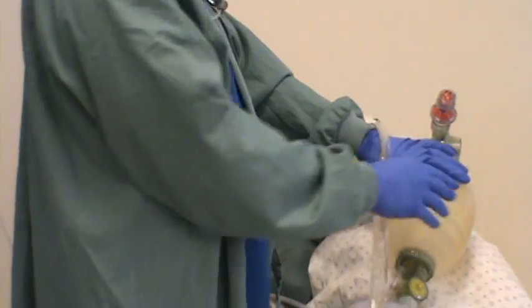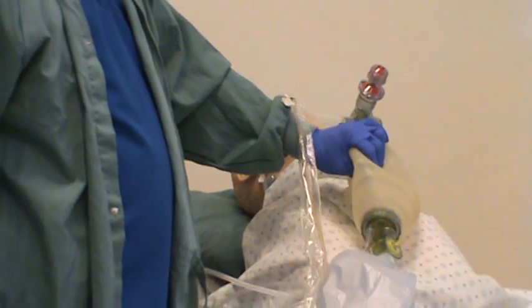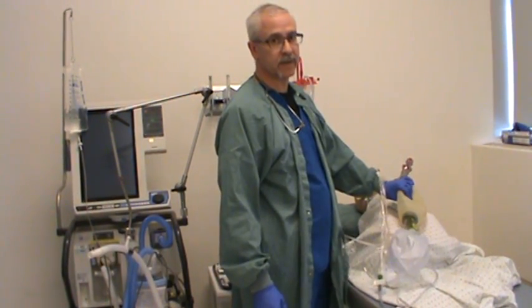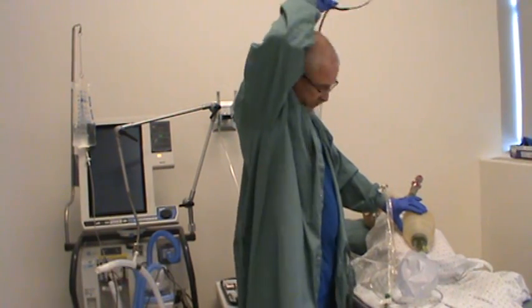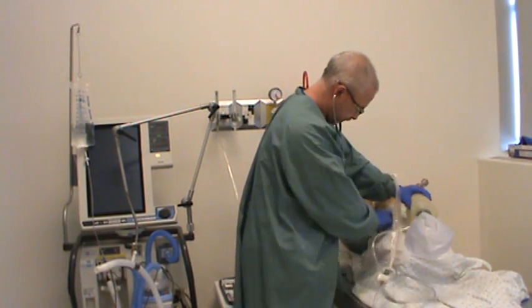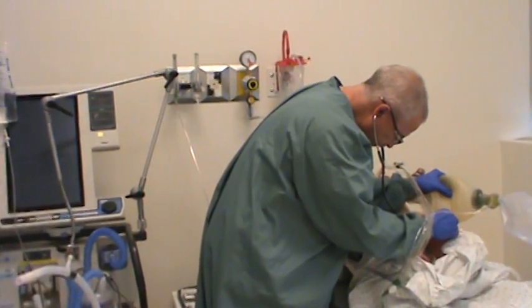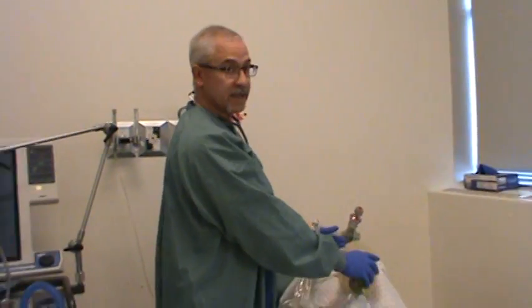Resume ventilation. I noted that I removed moderate amounts of yellow to white secretion from the patient. Let the patient recover, check their vital signs to make sure they are what they were before suctioning. Then go back and reassess — place your stethoscope in your ears and, while ventilating your patient, listen to see if they need to be suctioned again. It seems like my patient needs to be suctioned, so I'm going to suction them out one more time.